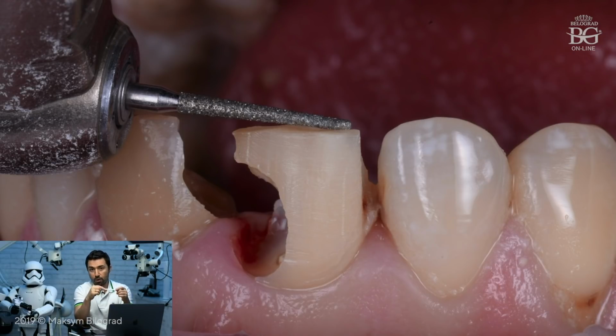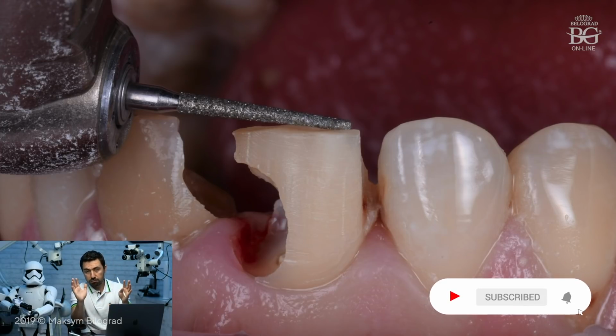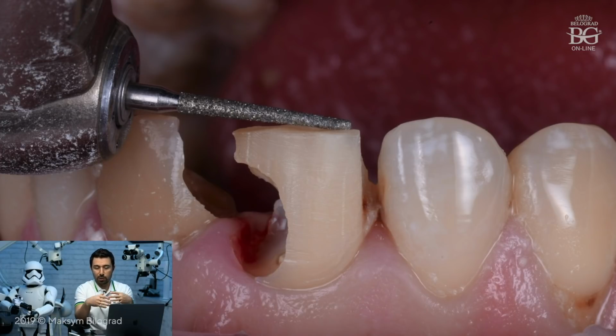Another super important issue is that after initial preparation, after removal of the caries, after removal of old fillings, etc., you may evaluate the restorative status of the tooth. In other words, you may understand if you will be able to restore this tooth afterwards or not. If you cannot restore, extraction and implant. If you can, you go. But before that, you explain this to your patient, and then if you say that we have to extract this tooth, unfortunately, that will not be a surprise for your patient. So you have to give these options to the patient as well.